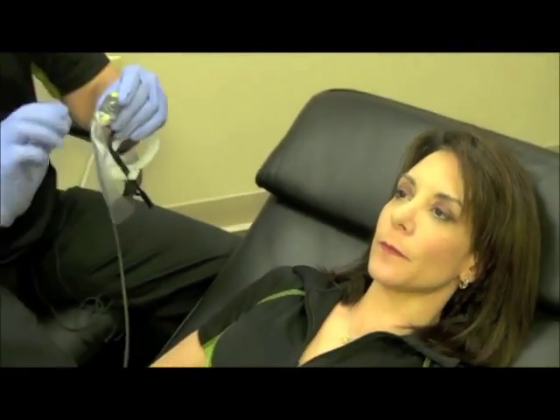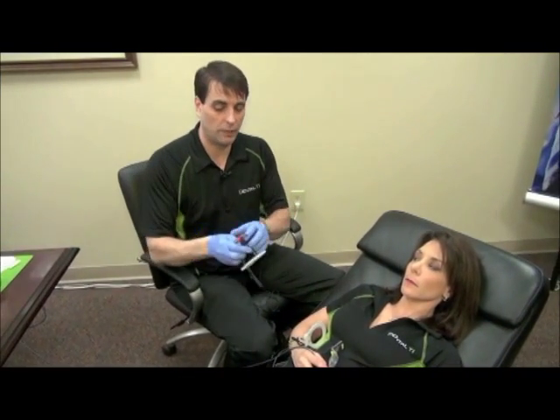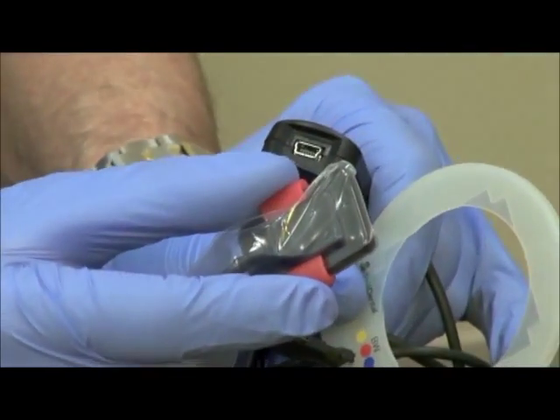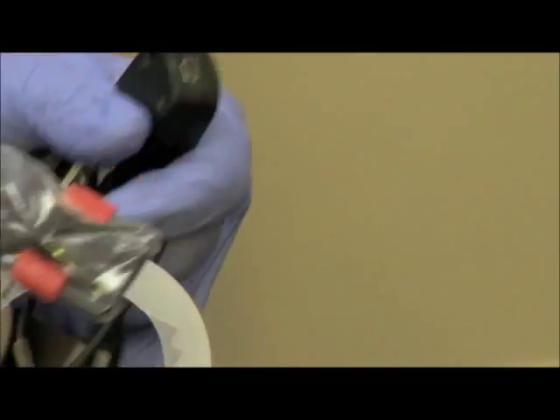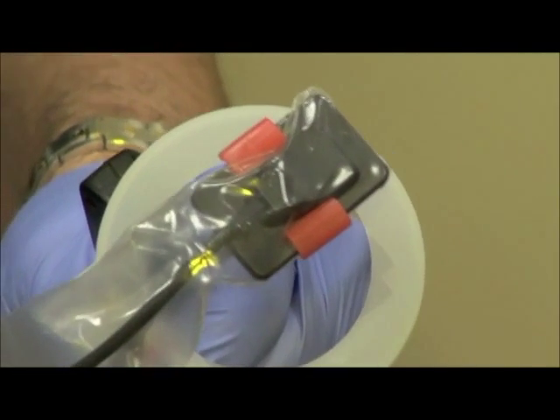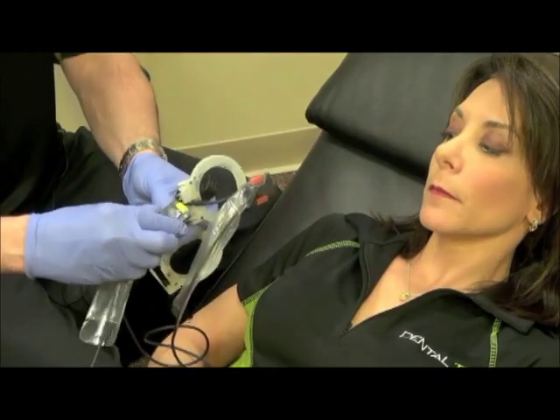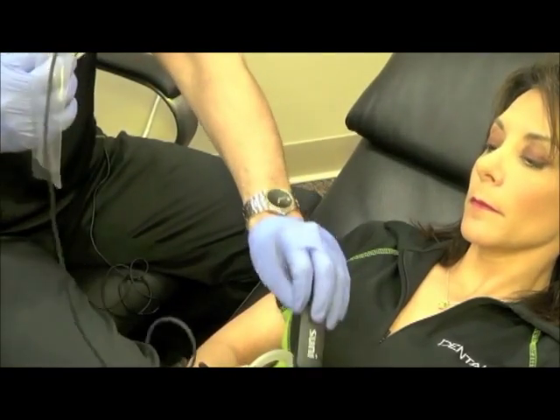That's how you take the bite wings with the yellow Camara holder. Another Trollbite product designed for taking bite wings is the red Camara holder. The red Camara bite wing holder holds the sensor on the long axis of the sensor top and bottom, whereas the yellow holds it on the short axis. They both work, but I really prefer the red holder because it allows you to get more even bone levels on maxillary and mandibular. With the yellow, the sensor can slip within the holder and you would pick up more of the maxillary bone than the mandibular, whereas the red holding it here does not allow it to slip vertically.